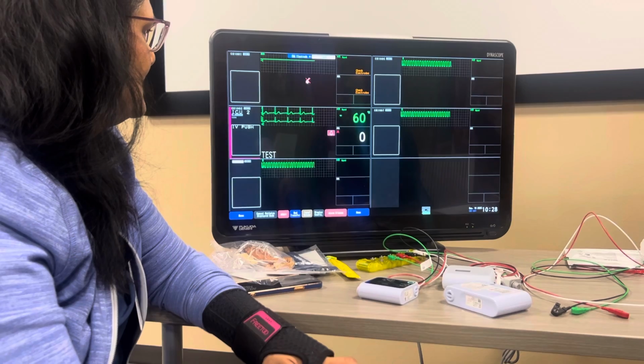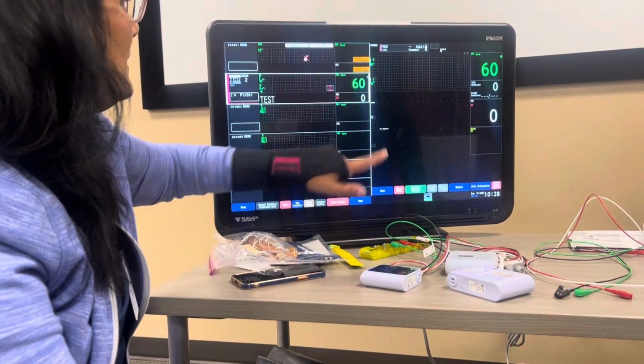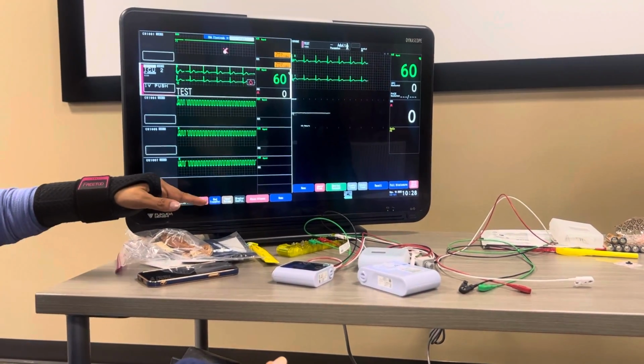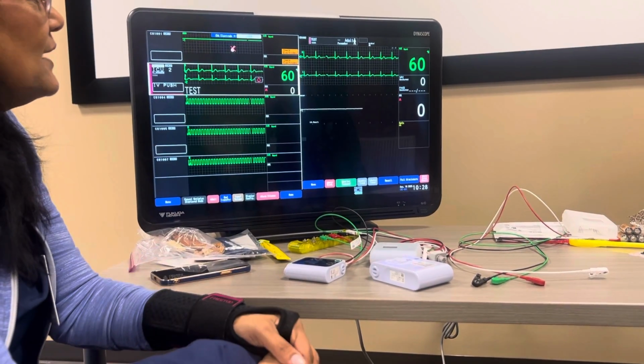Do you have to select the one first? Yes. Okay. So you want to select the patient. And now, because I just want to see the VTAC on this one patient, not on everybody, right? Because the doctor came. So that's why I always select your patient first. Okay, now where do I go?